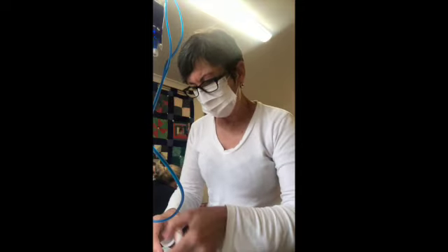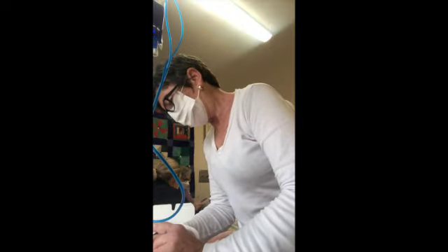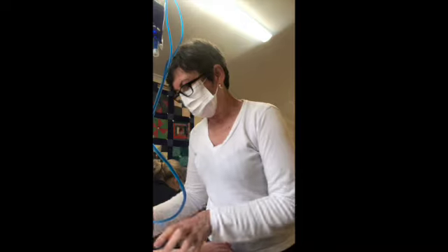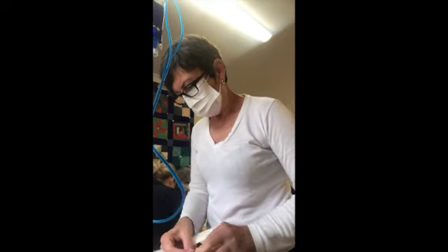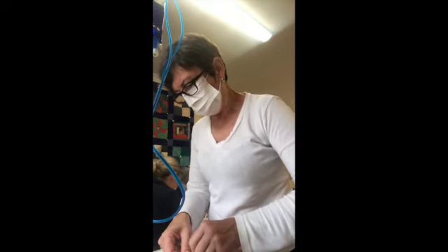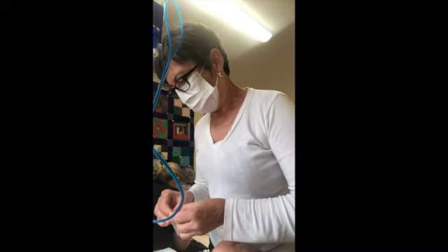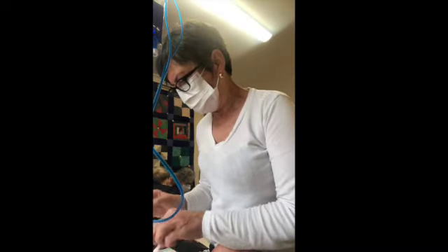So I guess the main points are, I'm definitely not doing it how I'll do it on Thursday, because I know it's not. I want to make sure nothing can fit in under that dressing. That's the whole point of it. And I don't want to be able to come along and pinch your head like that.